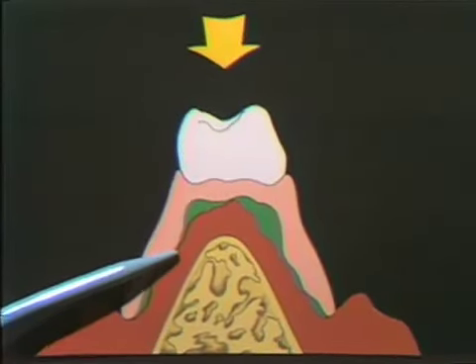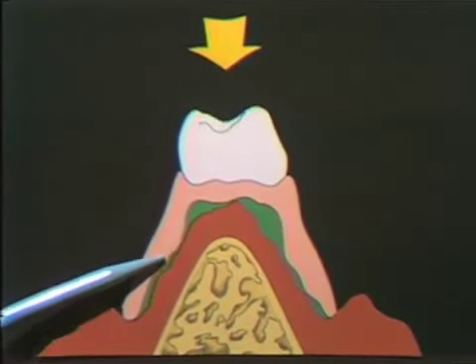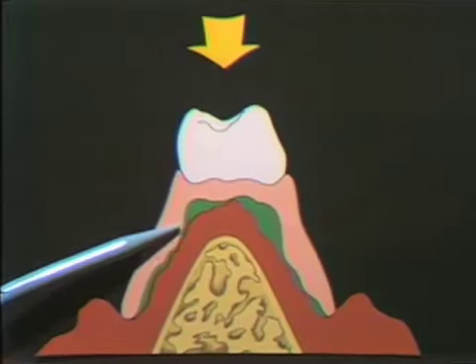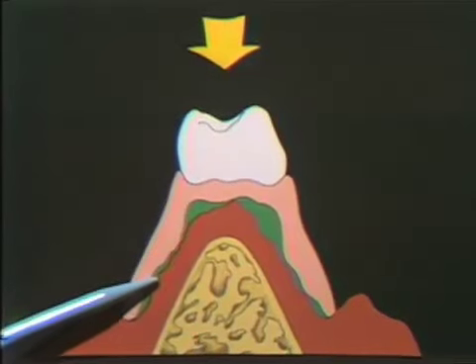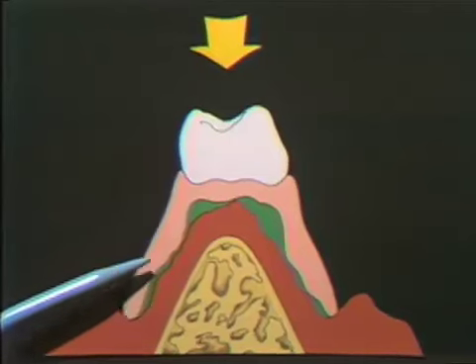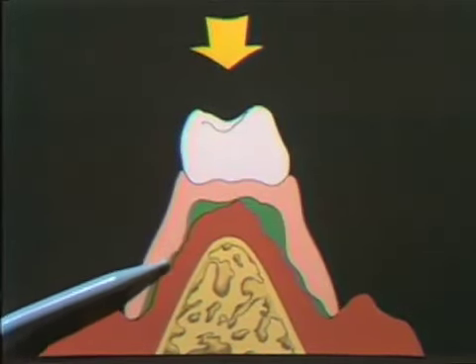Generally, if we have a sore spot due to this rubbing, we go in here and we relieve the inside of the base. In relieving the inside of the base, we make this base more ill-fitting, and thus we would have more movement. This movement creates a problem, the movement that is present in the conventional partial denture.